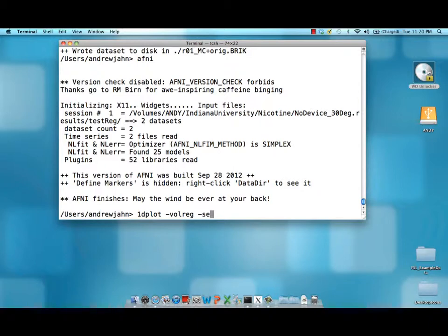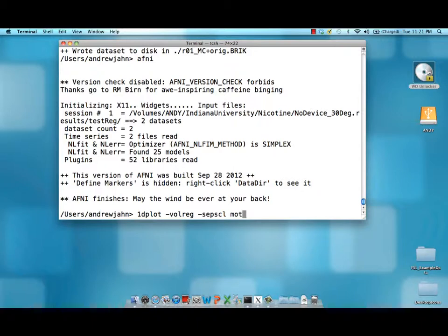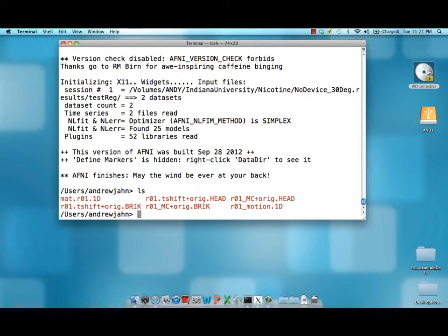Let me show you what this looks like. And also a separate scale to plot each of these motion parameters on a separate scale. Let me find out what I called it.